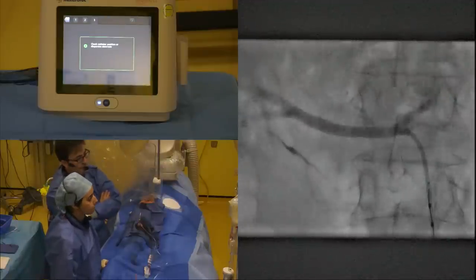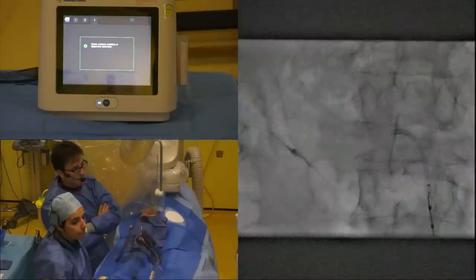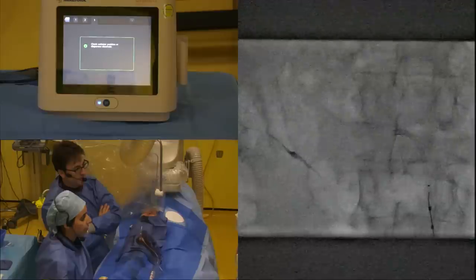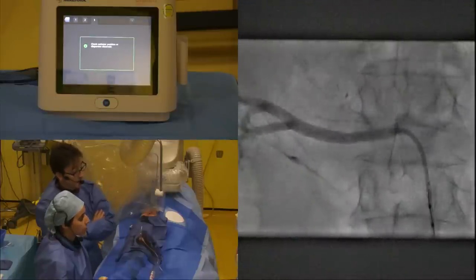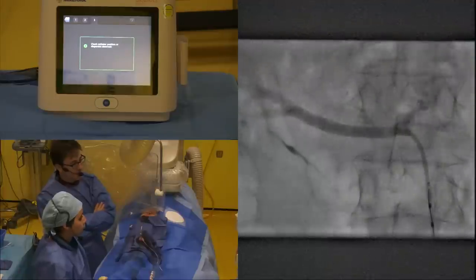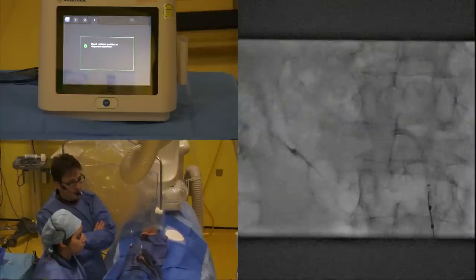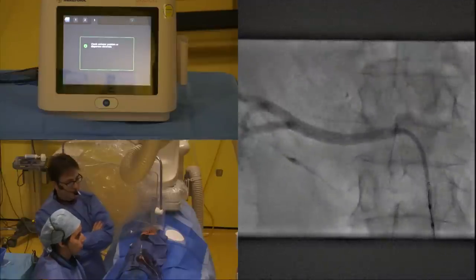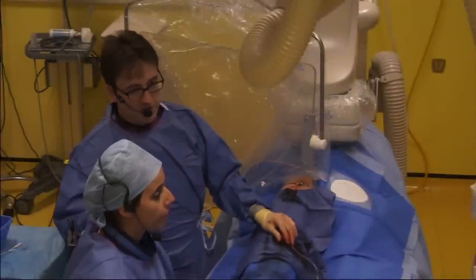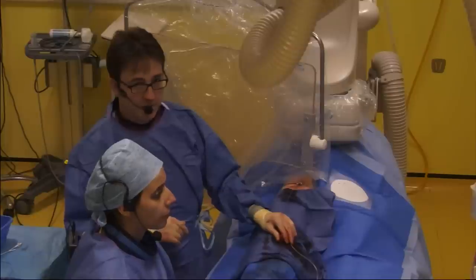We have an interesting question. You activated the two most distal electrodes. We were wondering whether keeping all four electrodes inside the artery, but activating the two most proximal, was better to have the spiral shaping on and adhering better to the vessel wall. At the same time, you have more purchase, so you have a more stable position with your catheter within the renal artery. That's quite good advice to me. I think that's an excellent question. Whoever suggested that should maybe be up here doing the case, but I think it's a very good point, and I think you're correct.